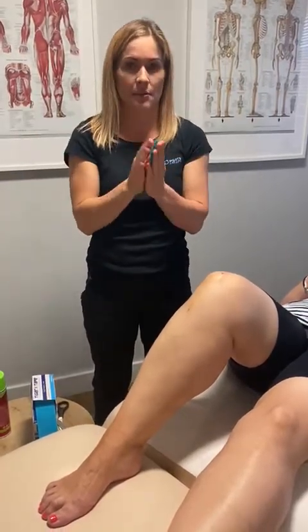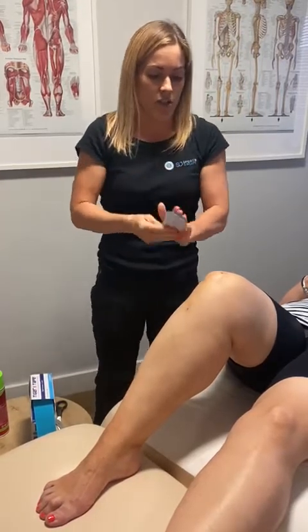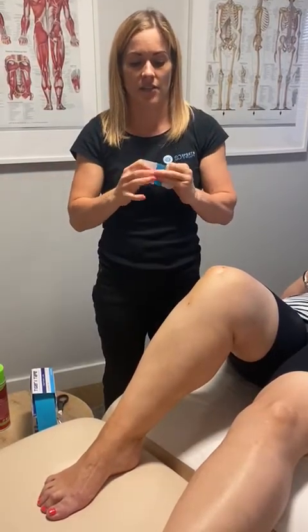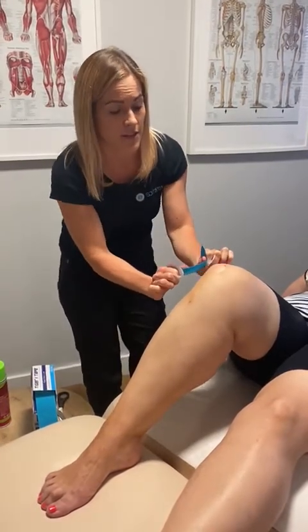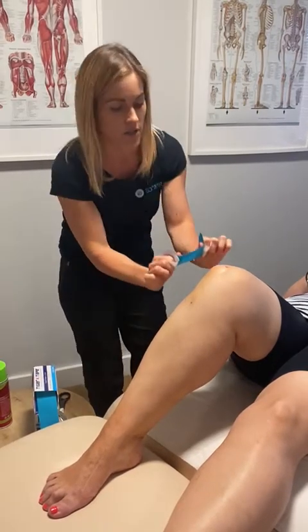So we've got a piece of tape, we can just rub it in our hands to get it nice and warm, all right? So we're going to peel in the middle of the tape here and just peel back the ends very slightly, okay? We're going to stick this to the outside of the knee with approximately 25% stretch, okay? So this is no stretch, this is about 25% stretch, all right?